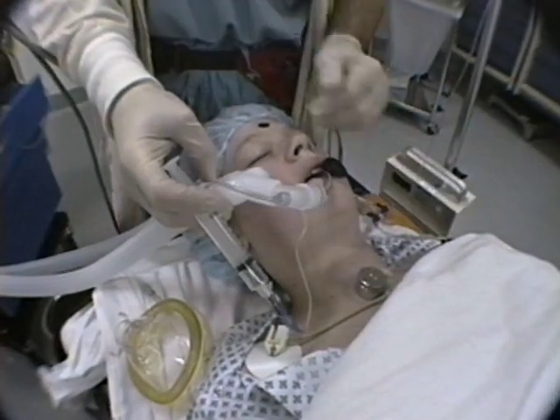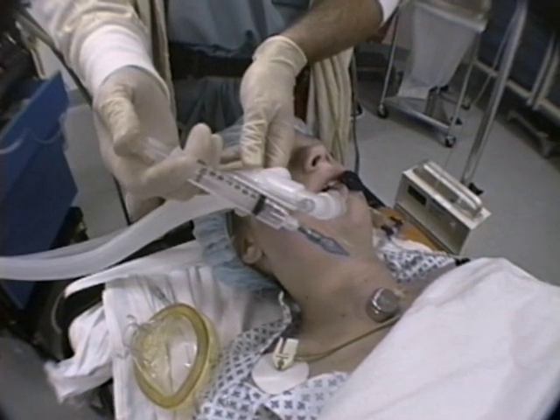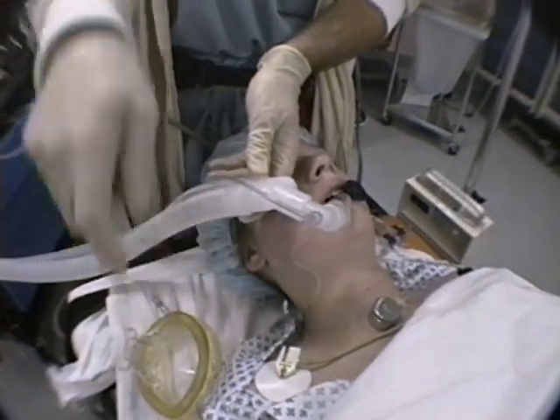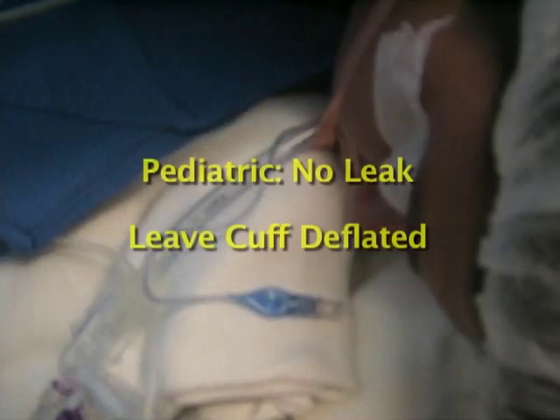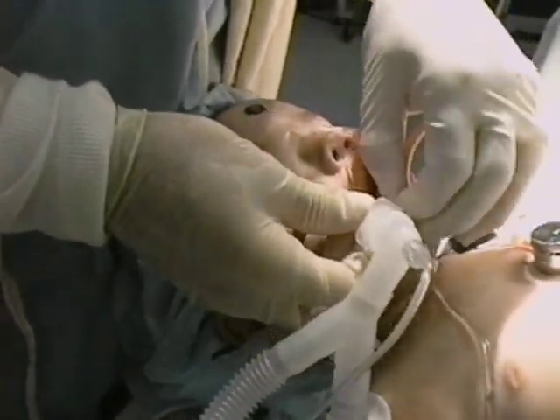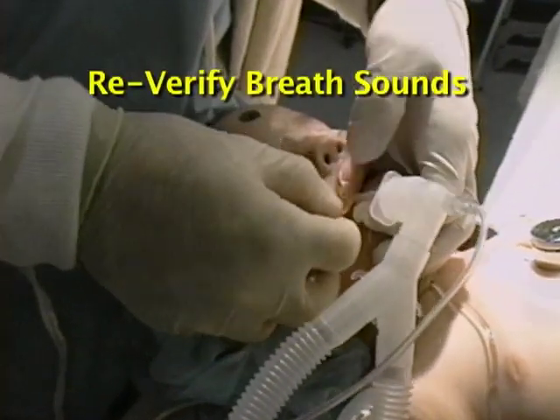In older children, when you're using a cuffed tube, check for a leak before you inflate the cuff. If there is a leak, inflate the cuff until the leak just vanishes. If there is no leak, leave the cuff deflated. Tape the tube in position and document the depth of insertion. Re-verify equality of breath sounds.